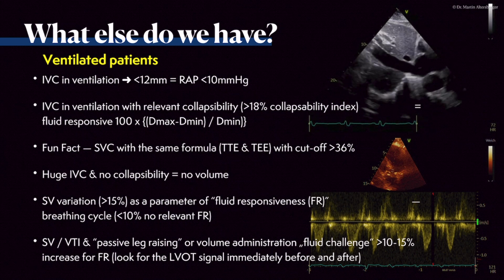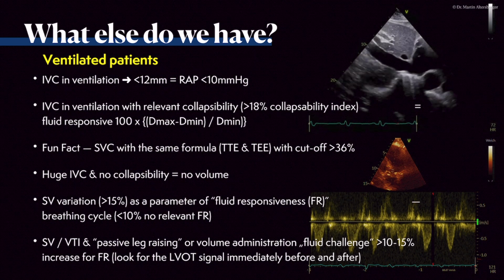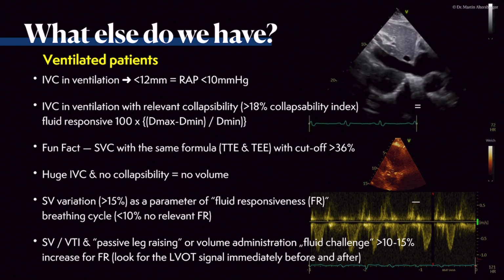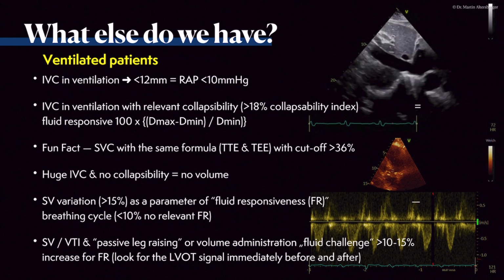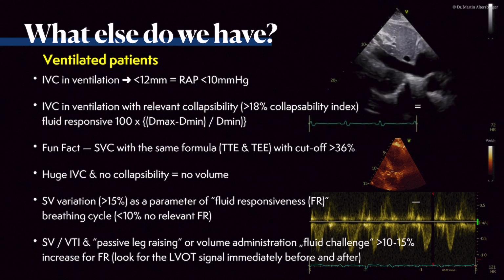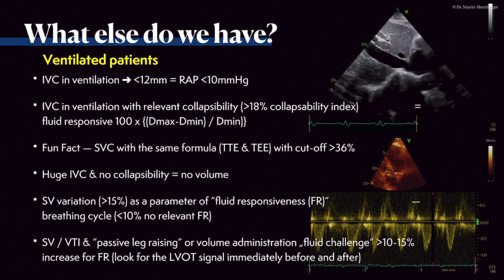If you do that and you see with this passive leg raising or the volume administration that there is an increase of VTI or the stroke volume of more than 10 to 15%, then most likely fluid responsiveness is given in this patient. Of course, you have to have an optimal LVOT signal with pulsed wave Doppler. You have to measure the signal before and immediately, and I would also recommend during a fluid challenge, during the passive leg raise test.